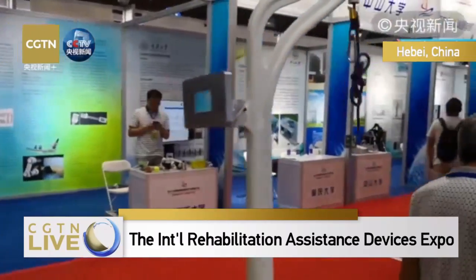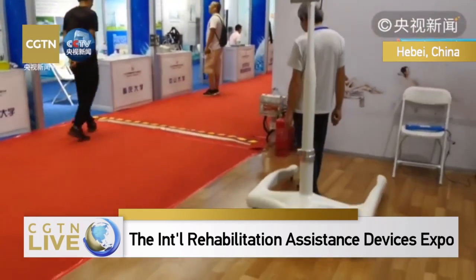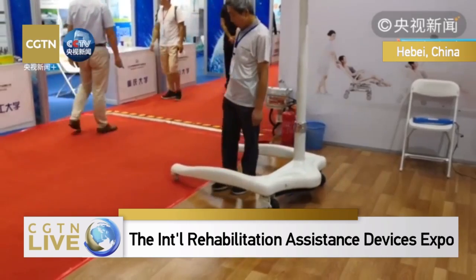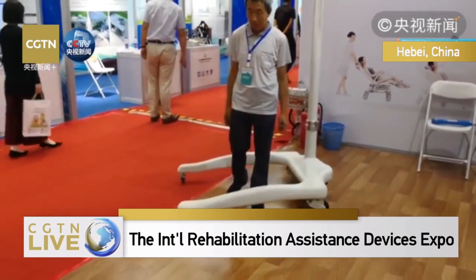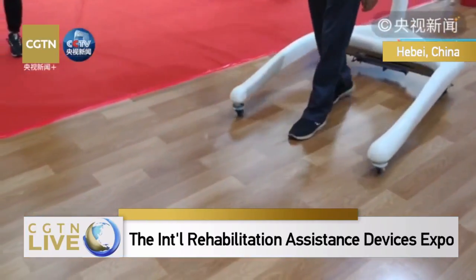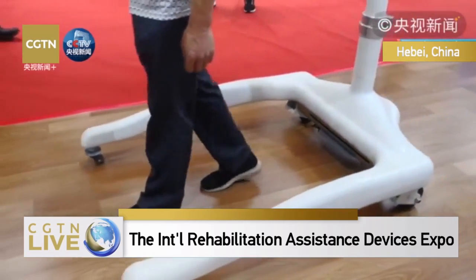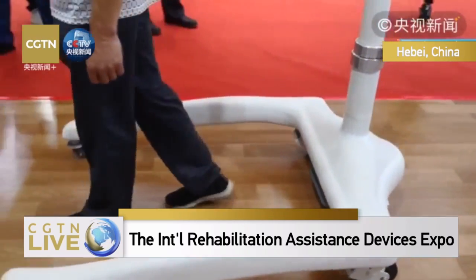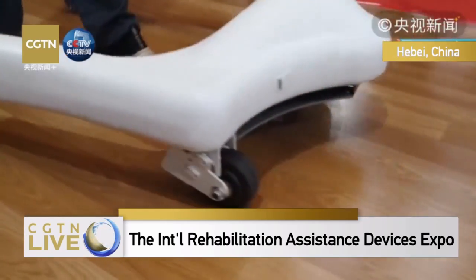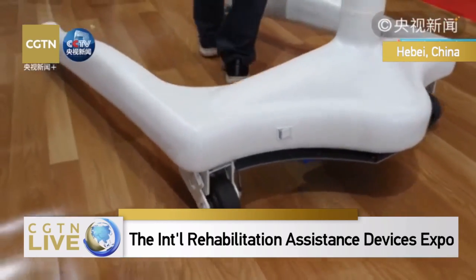In the case of a falling down, this rope can keep this person by strapping around the waist of the human being and support the weight of the human being. It has 3 sides and 4 points. And this shelf is made of carbon fiber.